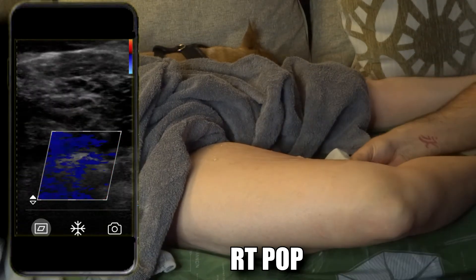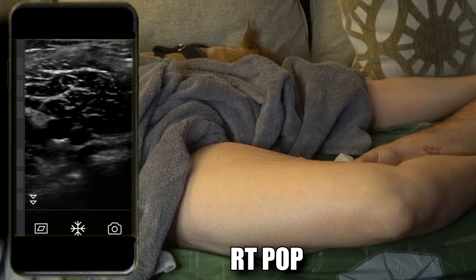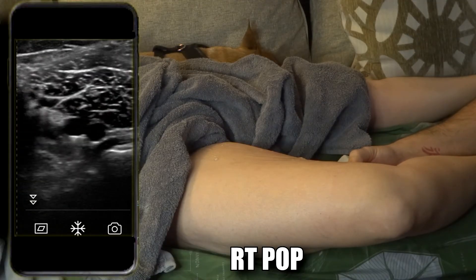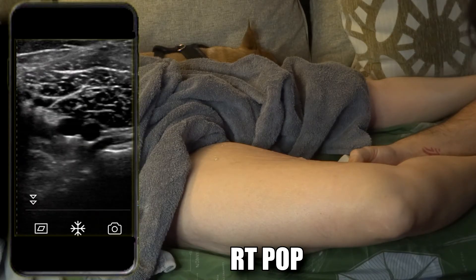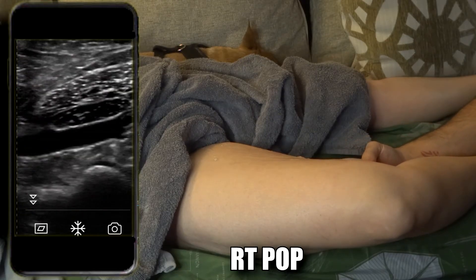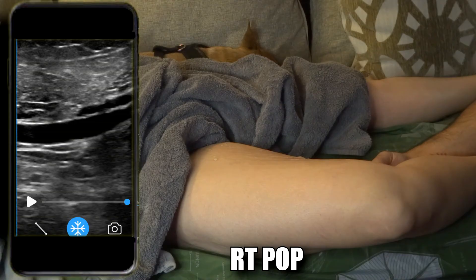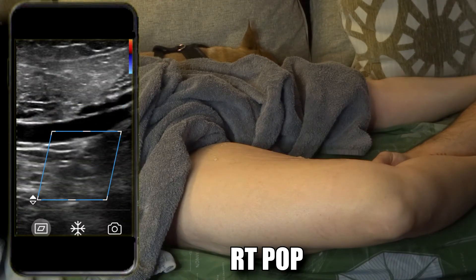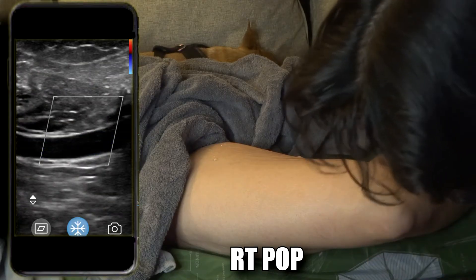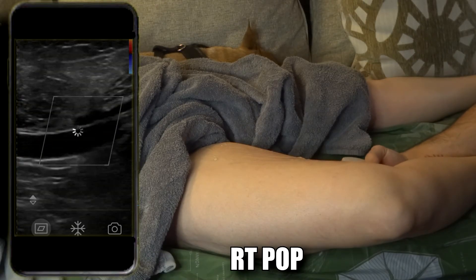Straighten the leg a little bit. Now go to the popliteal vein — behind the knee in the popliteal fossa, usually a very easy vein to see. Increase the TGCs. The popliteal vein is always going to be closer to the transducer because our approach is posterior, from behind the knee. Compress, freeze, take the picture, and sagittal. Nice, great scale image — that's the artery, this is the vein. Freeze, take the picture. Put color Doppler on — it's already steered. A little augmentation to see the flow. Rewind, perfect, take that picture.